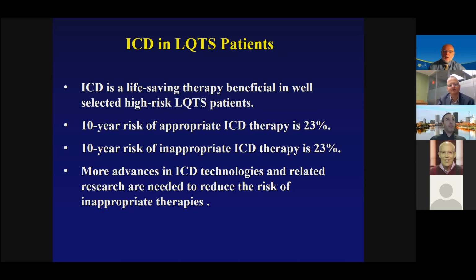Thank you, Wojciech, for the great talk. I do see one question addressed to that, maybe to clarify the distinction between pacemakers and defibrillators, because there are some patients who do have pacemakers, and they were asking whether they should continue with that or go to an ICD. So maybe clarify this distinction.